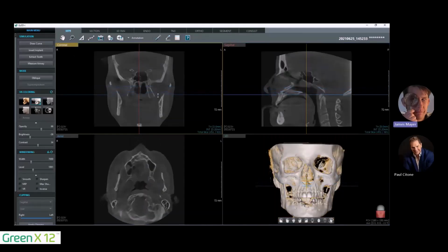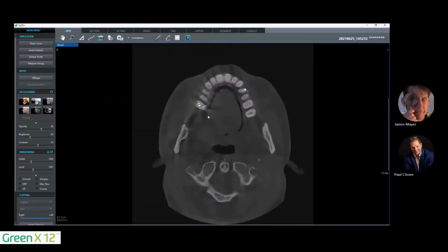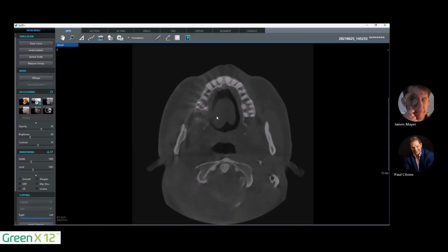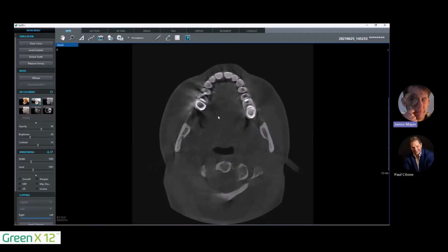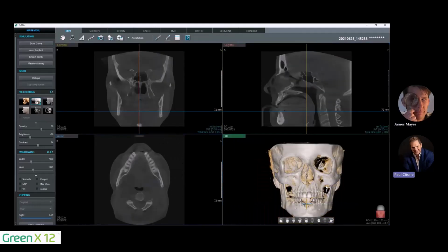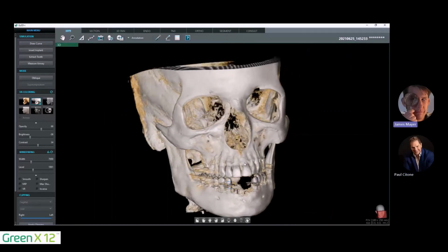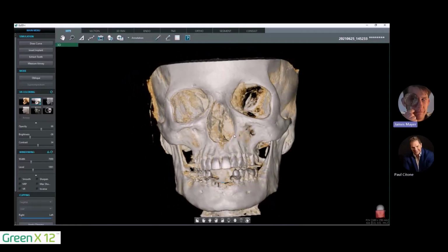We can scroll back down and let's look at our axial cut here off the gutta percha and our crowns. You see very little streaking effect through there, but that is some of that beam hardening within the data set itself. And that scatter, Jim, is basically the beam bouncing off of the restoration or the implant, creating that streaking. That is correct. Yeah, it cannot pass through. Yeah, so it is a reflection off of there.